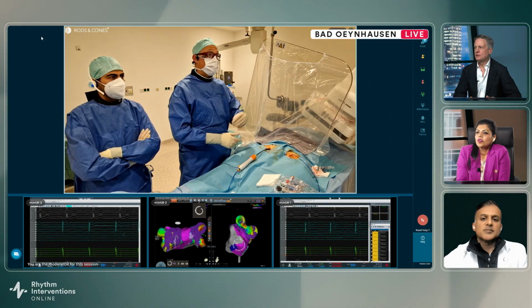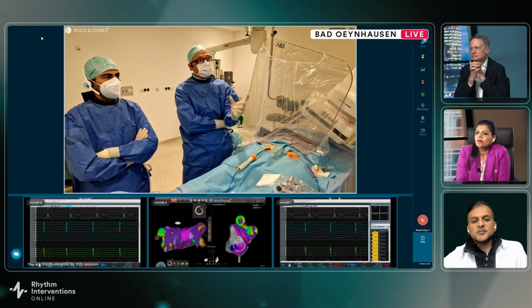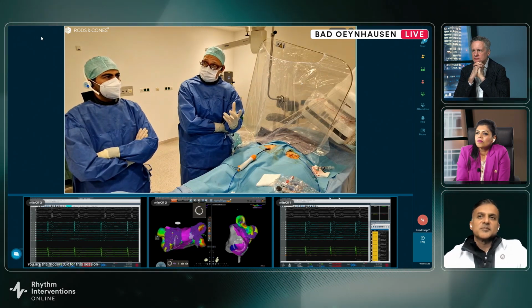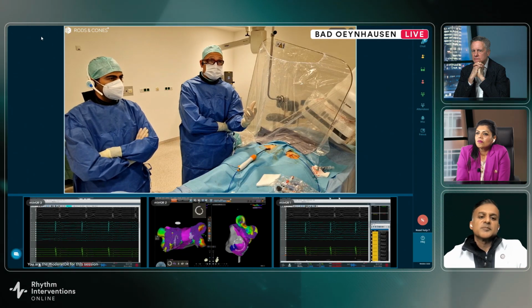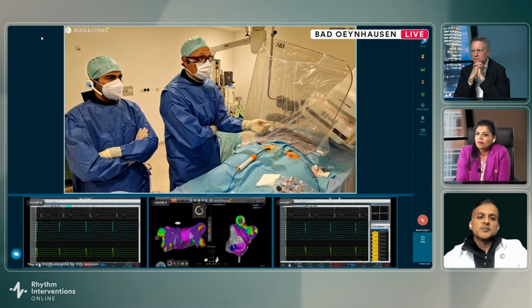What's your take on this scenario? It's something I can just speculate on, but we have data, for example, from the very pure and secure studies and so on. We're looking forward to this. We have the impression that after we perform ablation now with PFA in these patients, the recurrence rate seems to be lower. If this is true or not, I cannot tell you today.